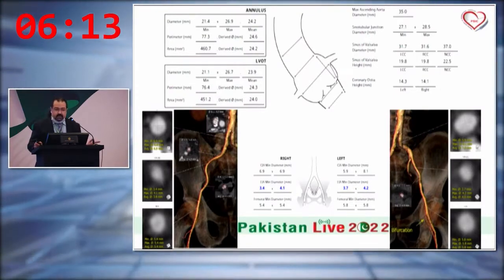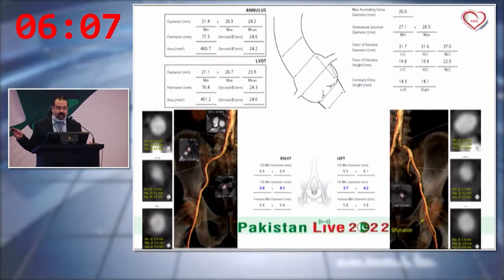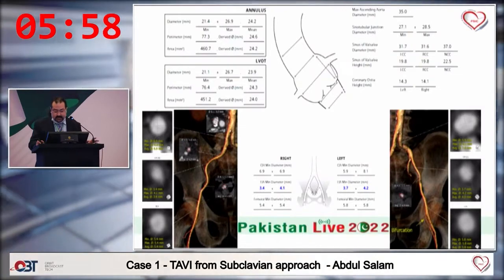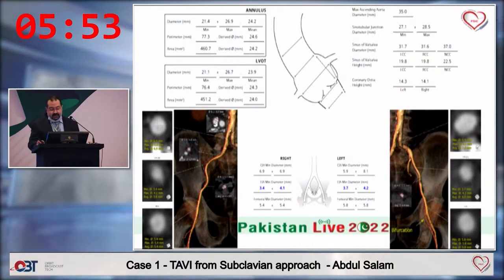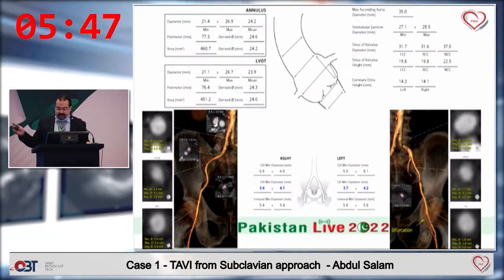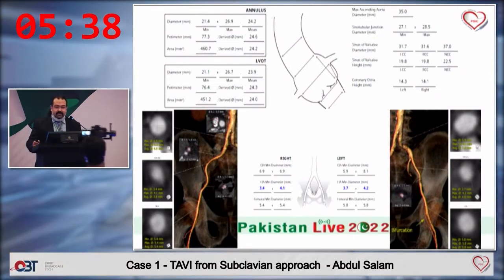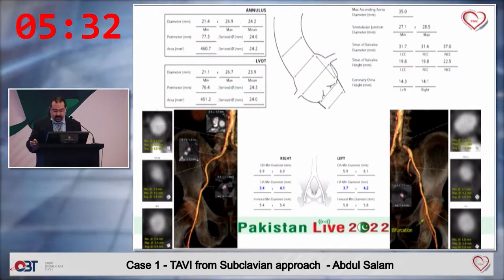Usually, our previous practice was always to do it from the femoral artery, but when we came to the femoral artery of this patient, it was slightly disappointing for us. His femoral artery size was not that bad, around 5.8, which is acceptable, because anything more than 5.5 is fine. But the more we go proximal to the iliac artery, usually the artery gets bigger and bigger. In this case, maybe due to disease or calcification, it was much smaller than what we need. It was just 3.7 on the left side and 3.4 on the right side. With this size, definitely we cannot put our large sheath because we would expect a lot of complications.